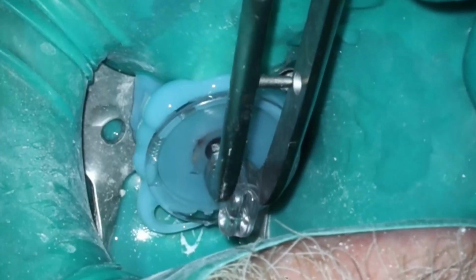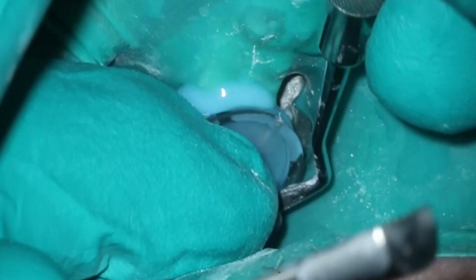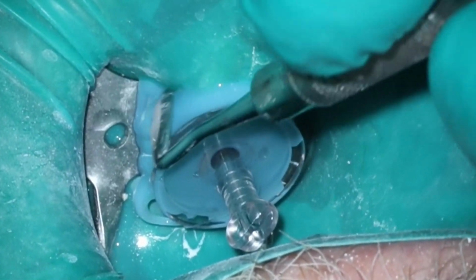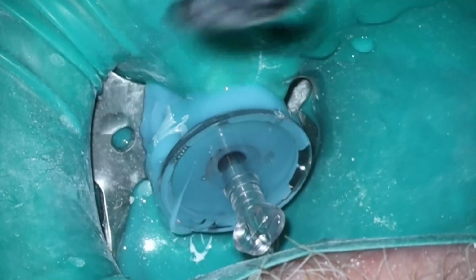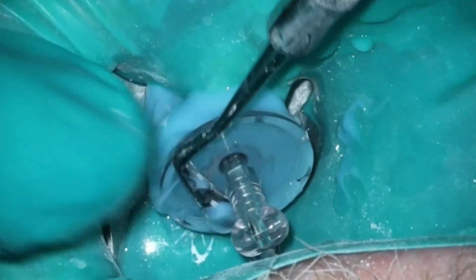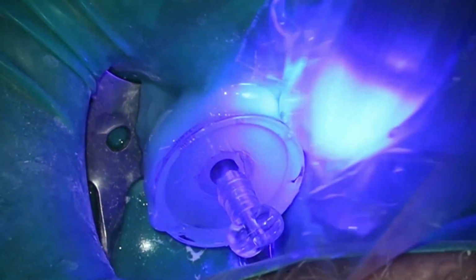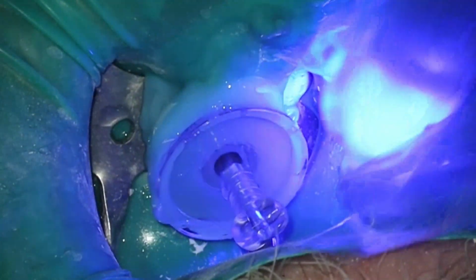Getting that in place. And you'll notice it's a little hard to hold in place. That's because the initial access was so large. For the smaller accesses that I tend to do, it's very nice because it holds the former in place. It has that little triangle that goes down to help form the shape of it, and that stabilizes it. The problem here is the hole is so large from the existing access that it moved a little bit more than I'd like. So you see, I had to do a few things there to get it to fit.